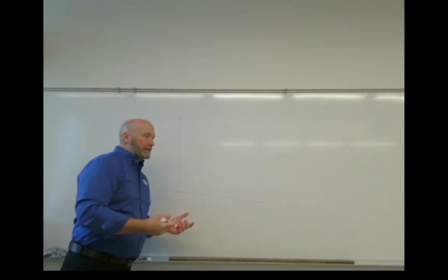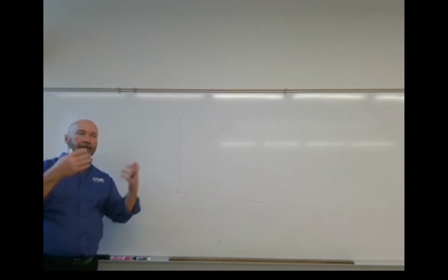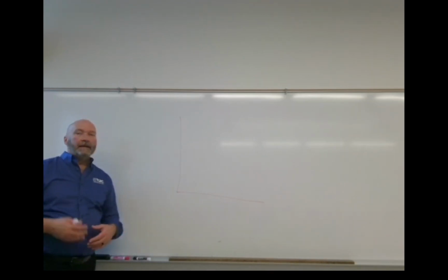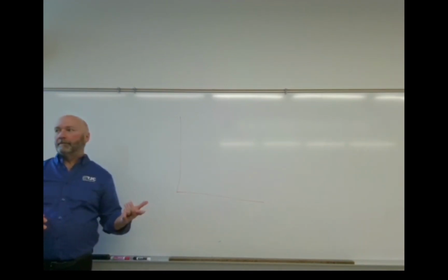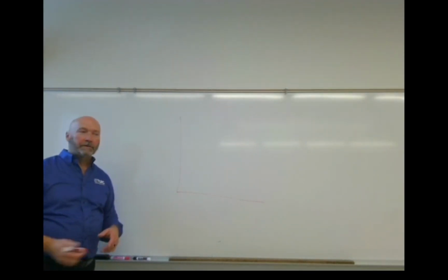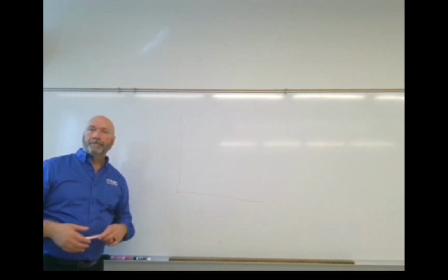If we had exhausted chemistry, you make the perfect exposure that should demonstrate good contrast and density, and what we would have is a lower density, probably a funny color on the film, and less contrast. That would indicate that we need to change the chemistry, flush the whole system out and start all over again. But let's assume that the chemistry is good.